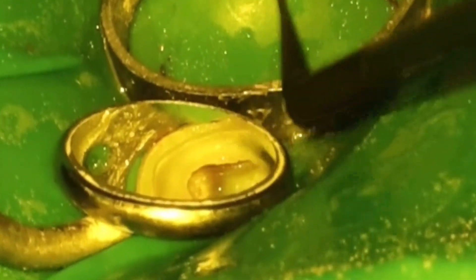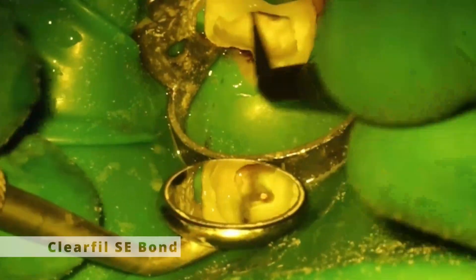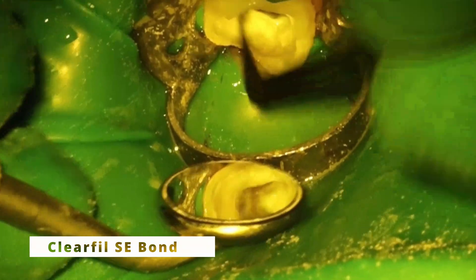This is why taking the CBCT is such a useful tool in this case: to know A, that you have one; B, what is the curvature; and C, where to drill if it is calcified — because these can be calcified as well. This is one of the more common retreatments I have to do on lower molars. I'm happy to say I've finally run out of my old Clearfil Photo Bond. I'm trying out both the one-bottle and two-bottle solution. I actually think I like the one-bottle solution a little bit better because based on the literature I've seen, they're pretty much equivalent — and only having to have the one bottle is really nice.